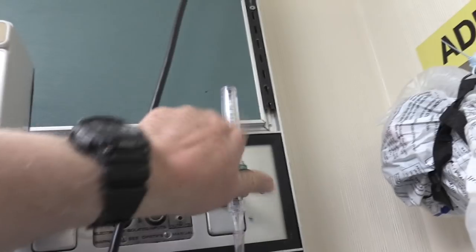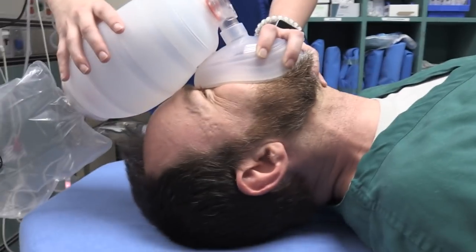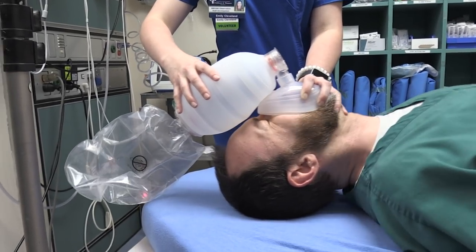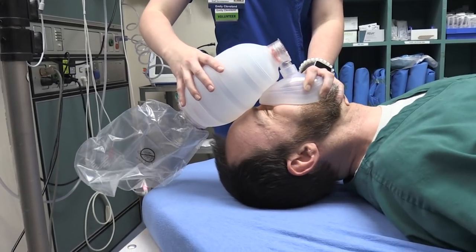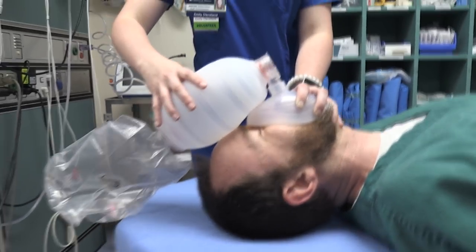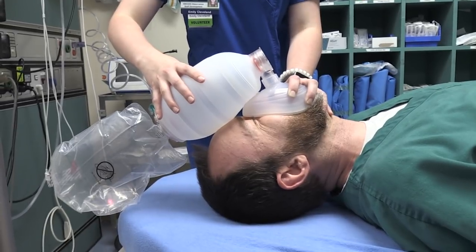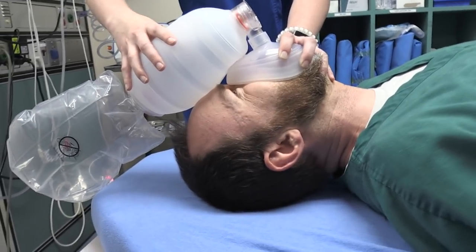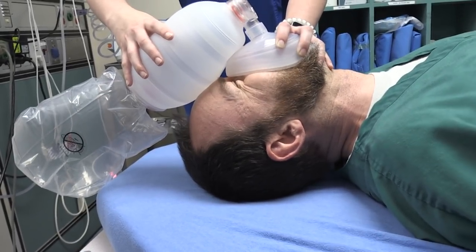I'm going to go over here, and I'm going to turn up the oxygen to maximum. You tell me how it feels when we do that. It's really hard. So I just cranked the oxygen up to max. Now hyperventilate. It's an interesting experiment. You could almost overcome your reservoir bag by hyperventilating, but it fills up extremely rapidly. See that? So Tim, how's the breathing feel? That's plenty of air.